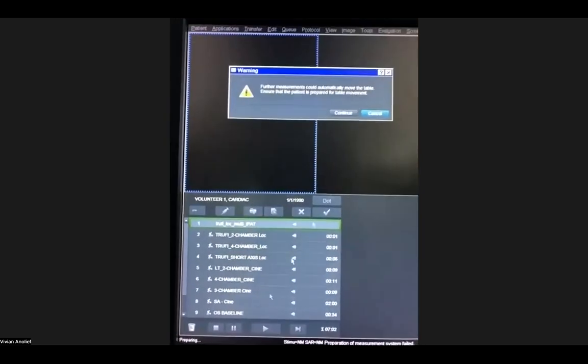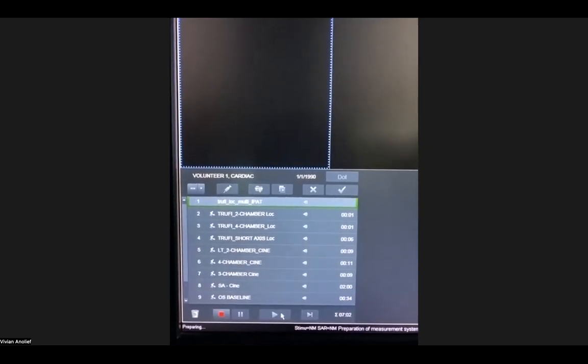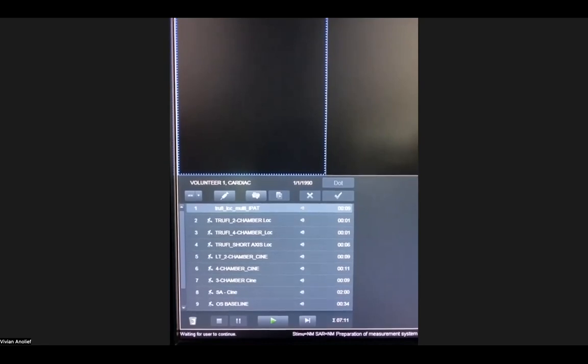So we'll just start with the localizer. We have Wally here scanning. Wally, you want to say hi? Hi. Okay, off we go. So it's 3 plane localizers. We'll have an axial view, a sagittal view, and a coronal view. We'll use that to plan our 2-chamber localizer. Since it's just a localizer, you can go a little bit fast with the planning. Basically, you always want to put the center of your slice mid-valve in the mitral valve, and then point the tip of the slice through the apex.